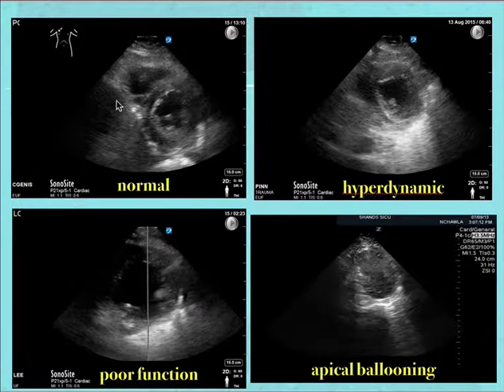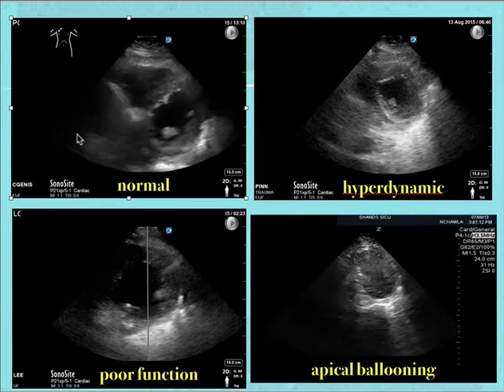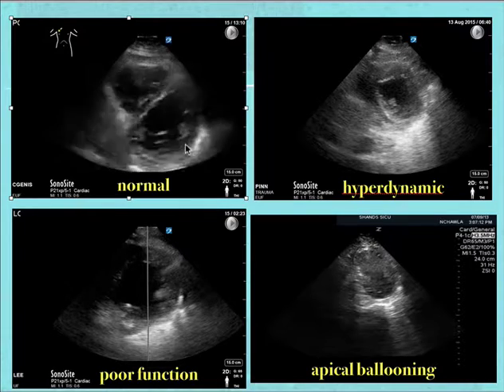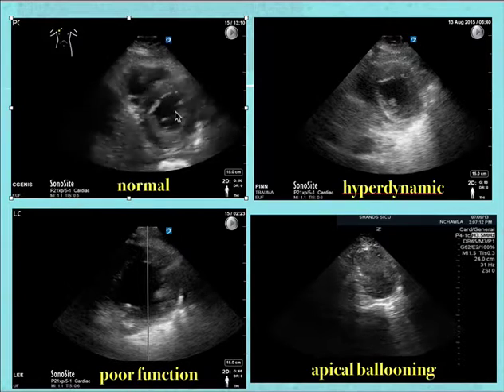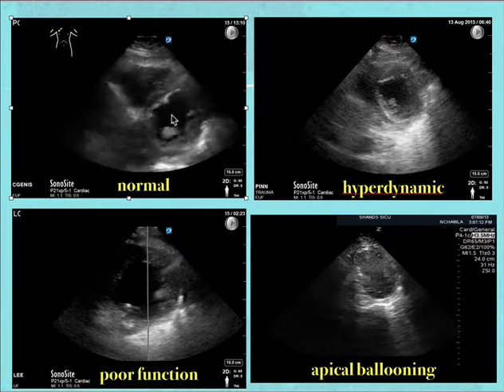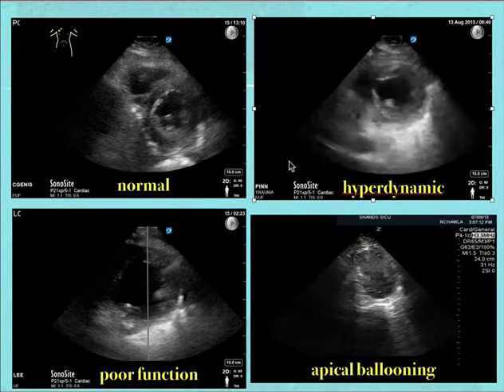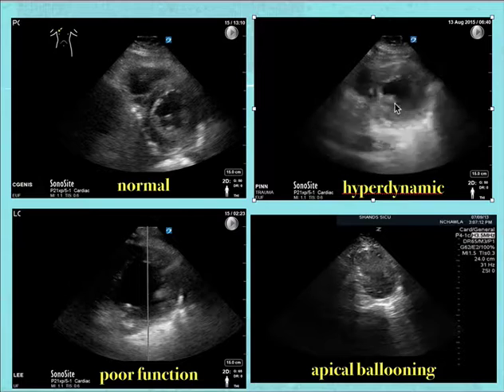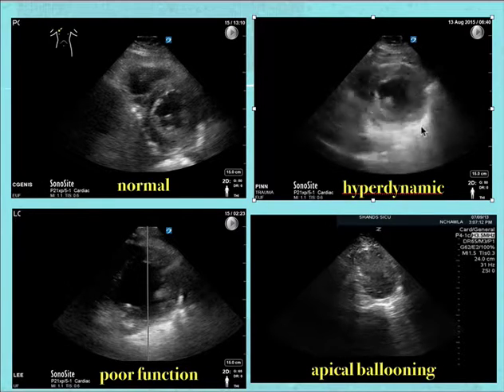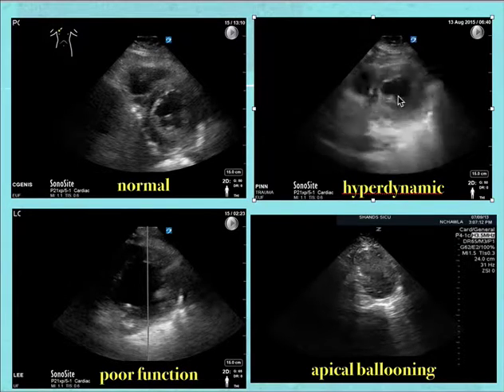Now let's look at short axis views. In a normal view, you see the left ventricle with the papillary muscles, the cavity has blood in it and is not totally obliterating — this is normal LV function. In a hyperdynamic example, always identify the papillary muscle first. If you don't see it, you might be at the apex — and at the apex, it always looks like kissing ventricles or total collapse, so you may overestimate function.